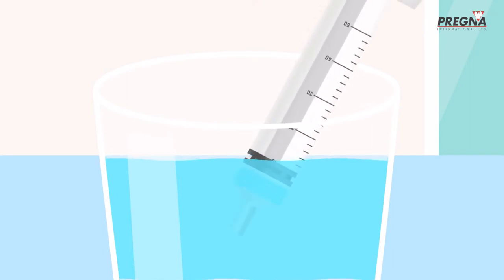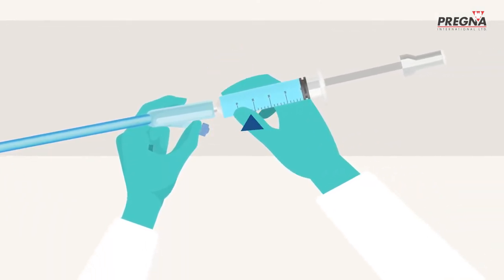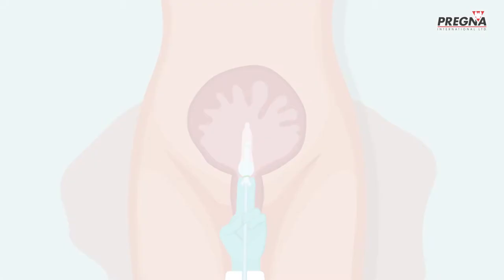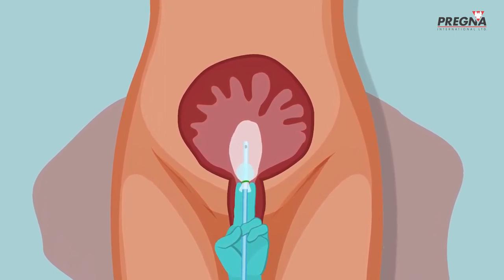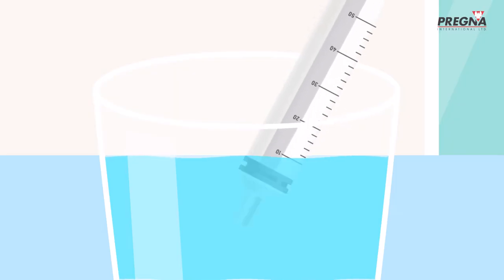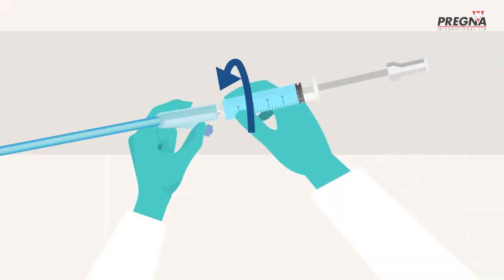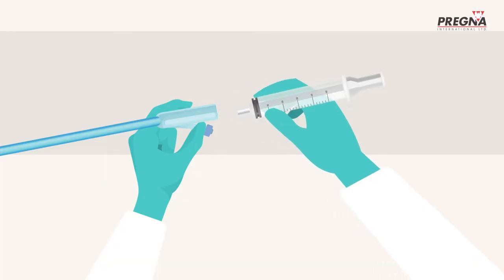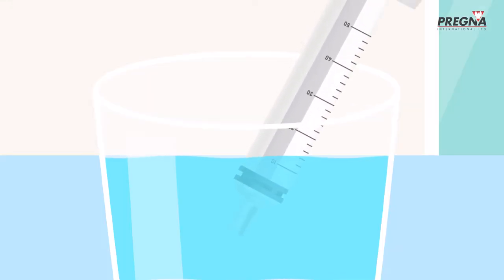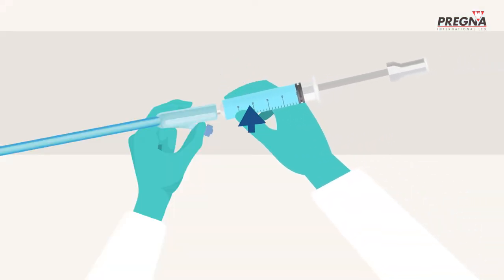Anita then draws 50ml of normal saline into the syringe and attaches it to the one-way valve in the catheter. She pushes normal saline into the main condom balloon inside the uterus. As the balloon fills with saline, it inflates. She repeats this action using as much saline as necessary to stop the bleeding — this usually requires 300–500ml of normal saline. Each time Anita removes the syringe to refill it, the one-way valve in the catheter prevents the saline from coming back out.